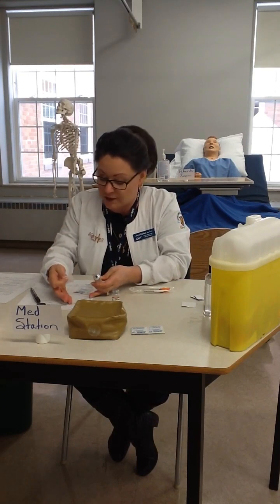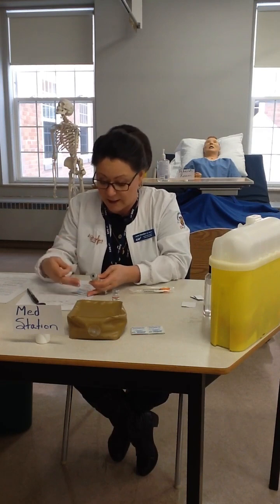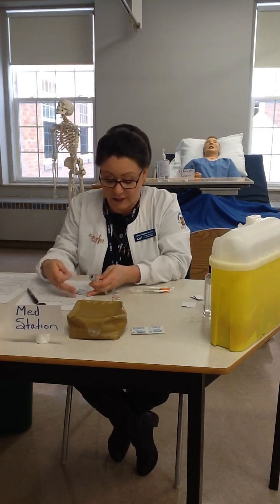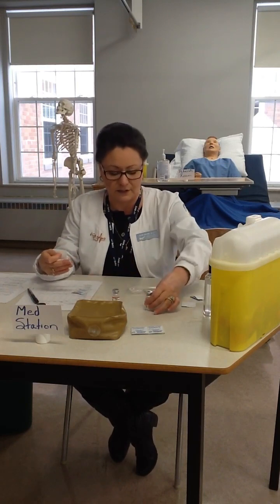I'm going to start right at the top. I have the right patient. I know I have the right drug, insulin R. I don't have the right dose yet. I've given Jesse the right education. I know the right reason. I've done the assessment. I've gotten the blood glucose level. I'll do the right documentation after I've given it, and evaluation is ongoing. Let that one continue drying.